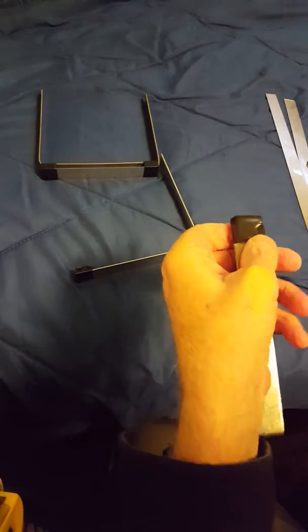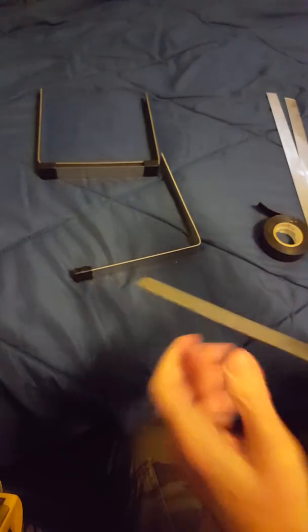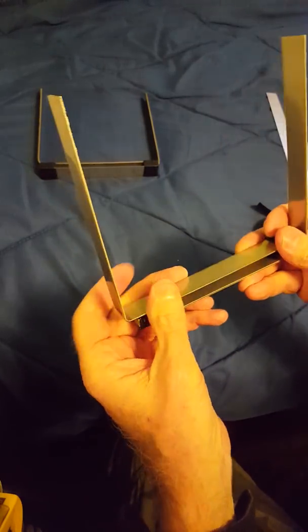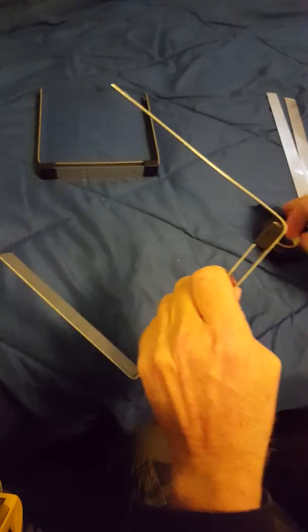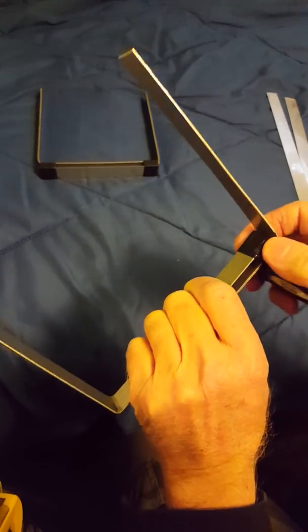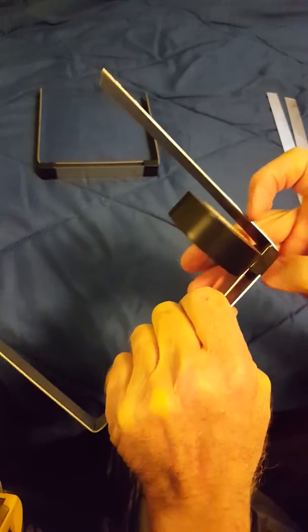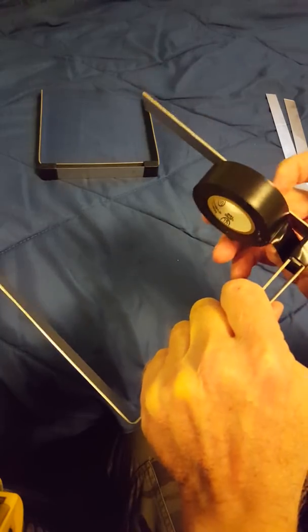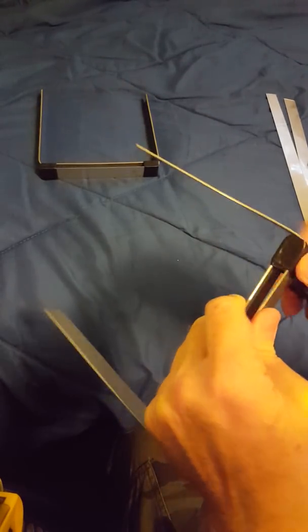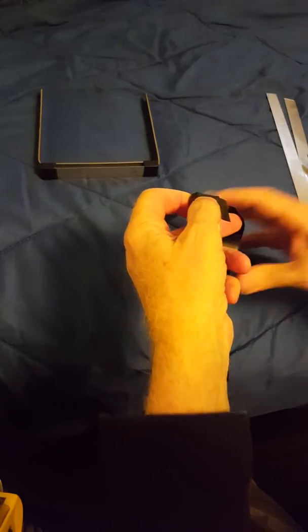Okay, there. Now we're going to snip this off. Okay, now we join up one with the other like that. And then what you do is just start wrapping here. And I would give it about 3-4 good turns. Like that. Snip it off. Let's start the other one.